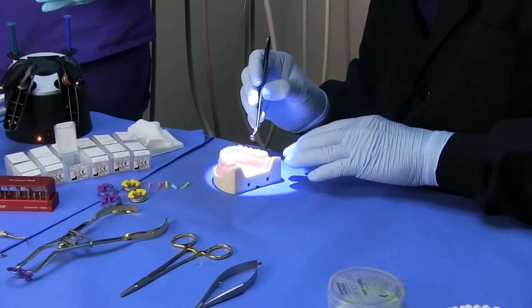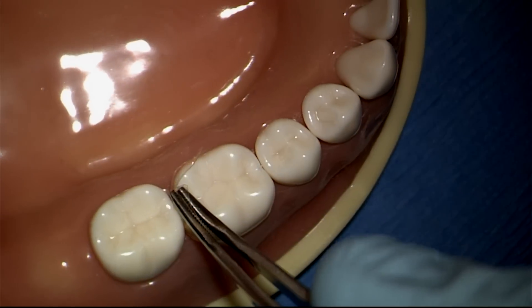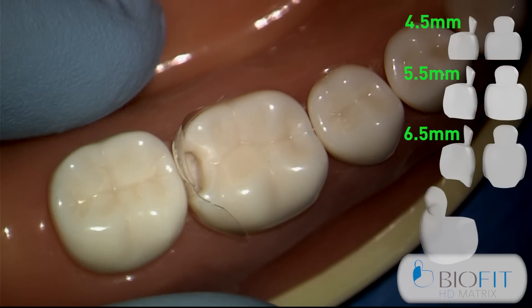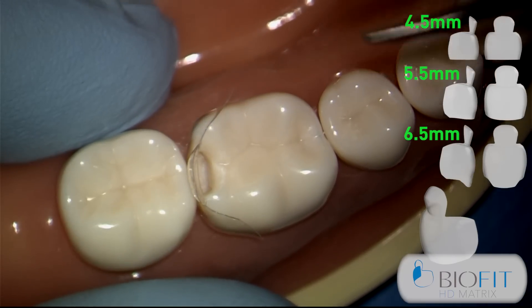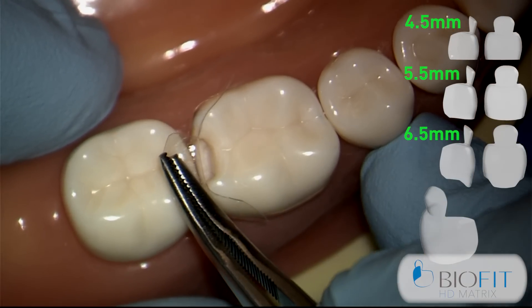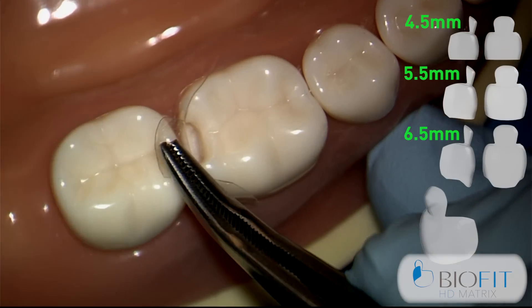What you're going to notice with the new Bioclear posterior matrix is it has a tremendous anatomical shape and there are some new features that I hope you really enjoy. We need to make sure that the tab is centered over where the restoration is going to be placed. This is a great advantage because we're going to fold this tab down and this will disallow any composite to go on the wrong side of the matrix.